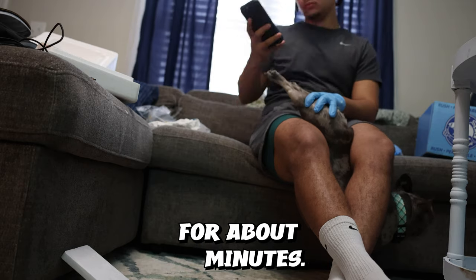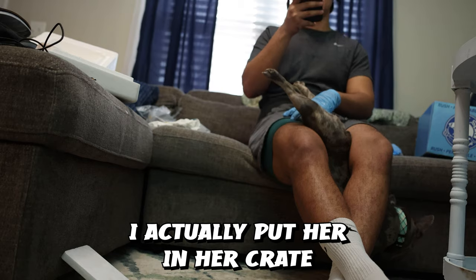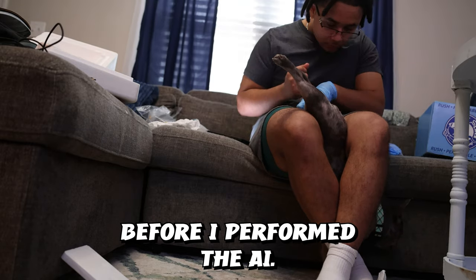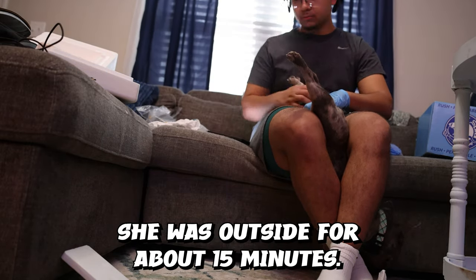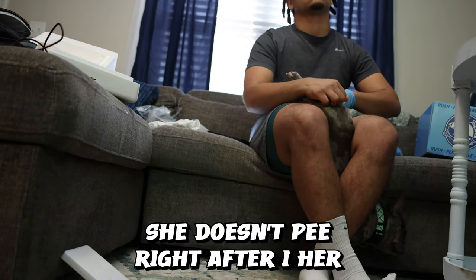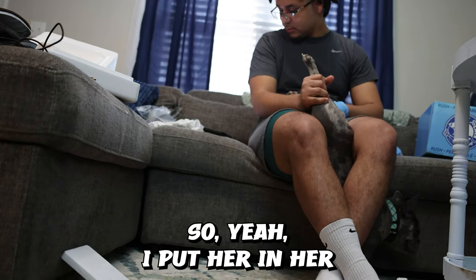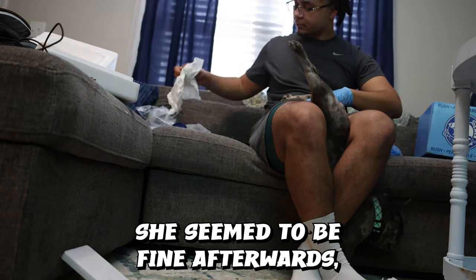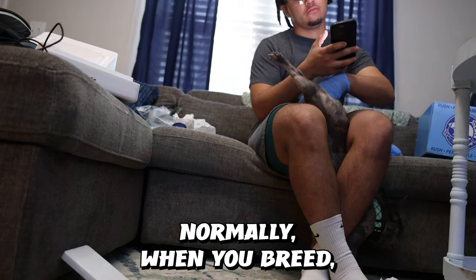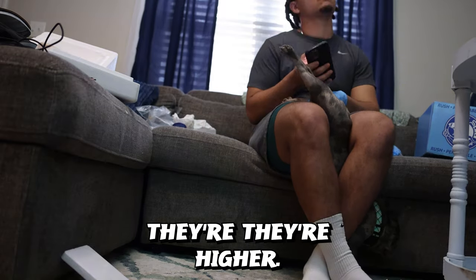I had her in this position for about 30 minutes. Right after that I put her in her crate for a couple of hours. She was also allowed to pee and poop before I performed the AI — I made sure we were outside for about 15 minutes and she peed multiple times and also pooped. This is so she doesn't pee right after the AI and have everything come running out. I put her in her crate for about two hours and she seemed fine afterwards. Unfortunately I wasn't able to do a second AI — normally when you breed you want to do two breedings with a day in between to increase the chances of pregnancy.